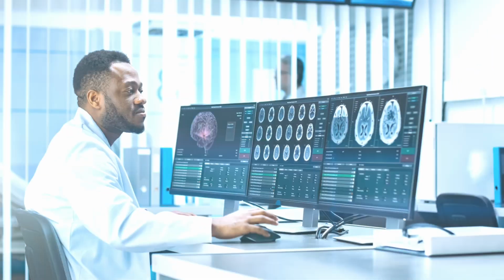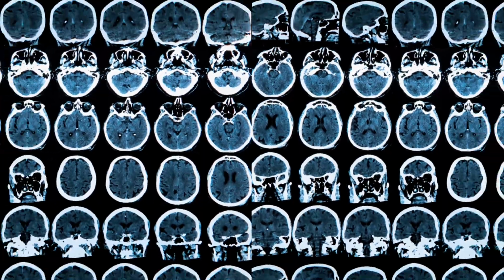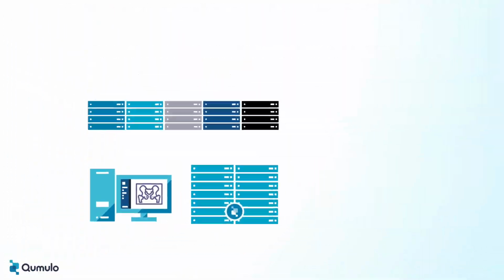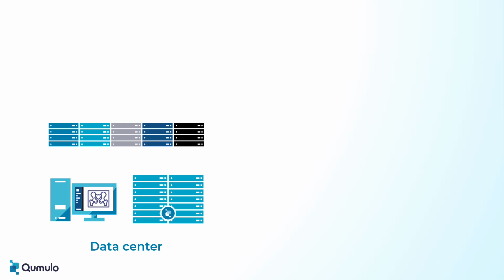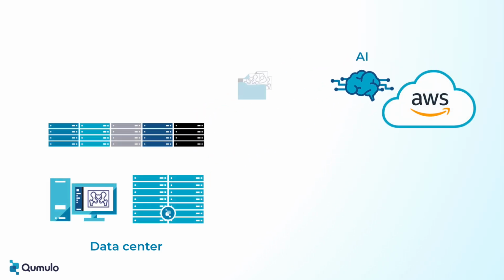Imagine you're the IT director for a cancer research facility at a major university, where you're responsible for managing dozens of petabytes of imaging files. One of your remote research teams has asked you for help with a new project. They've developed a cloud-based AI engine that can detect breast cancer tumors in medical images, and they'd like to validate it against some of your existing image data.